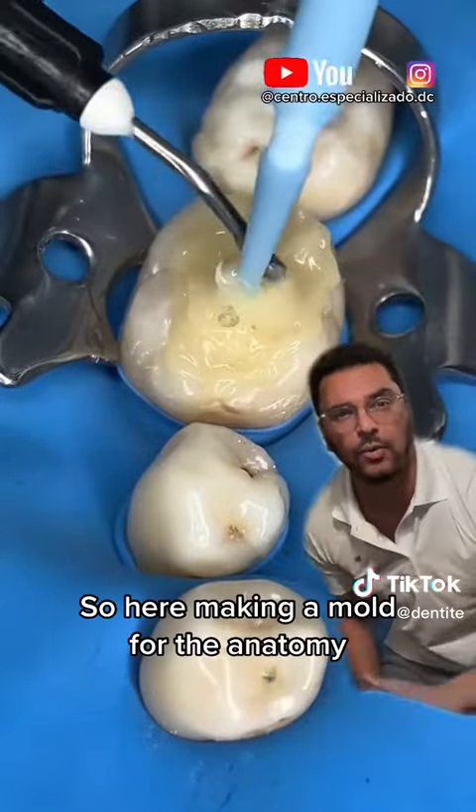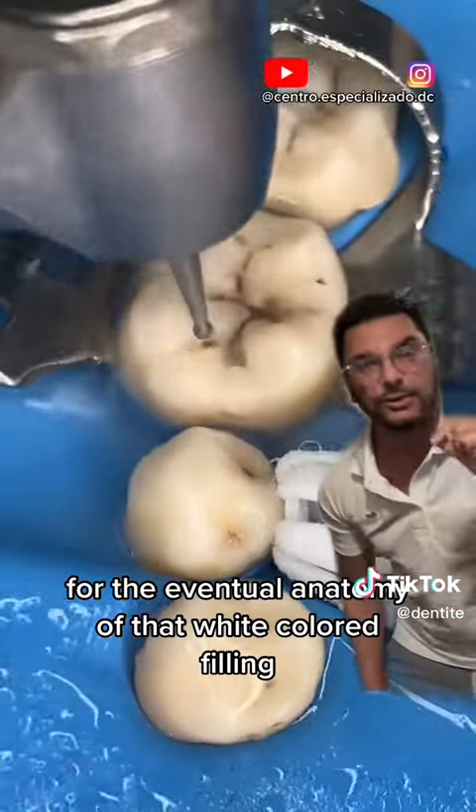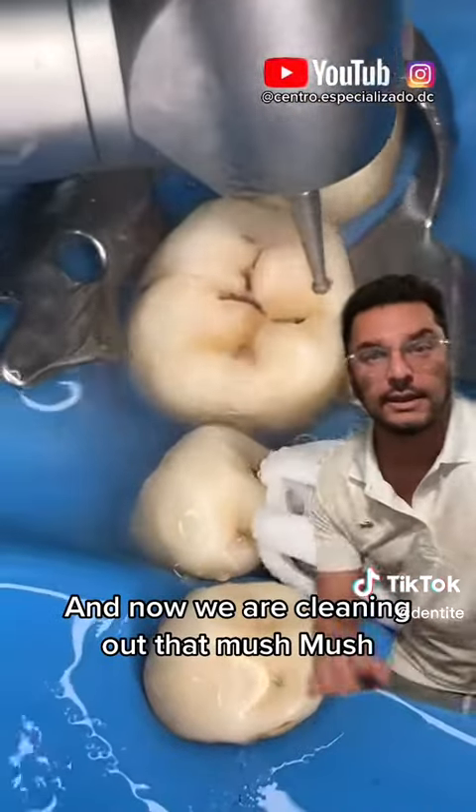So here, making a mold for the anatomy — for the eventual anatomy of that white colored filling. And now we are cleaning out that mush mush.